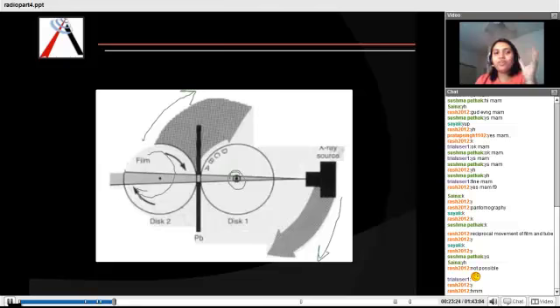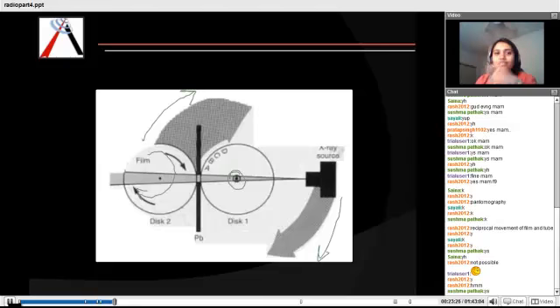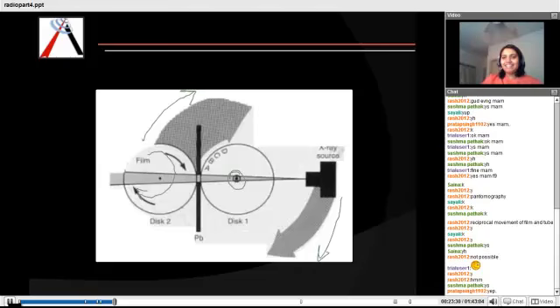Hopefully you know the difference between rotation and revolution when we talk about it. Something like the sun and the moon. It's the same concept over here. Now look at this. Imagine this particular disc now goes in here.